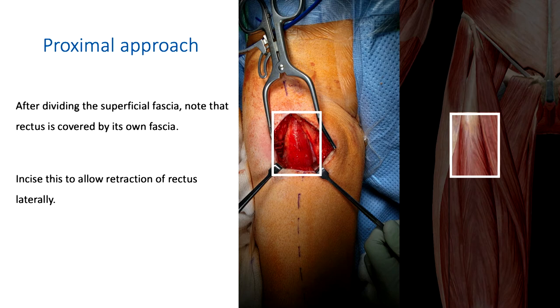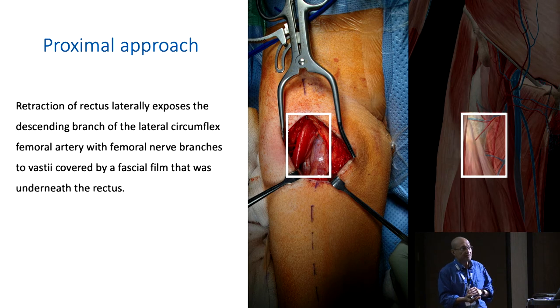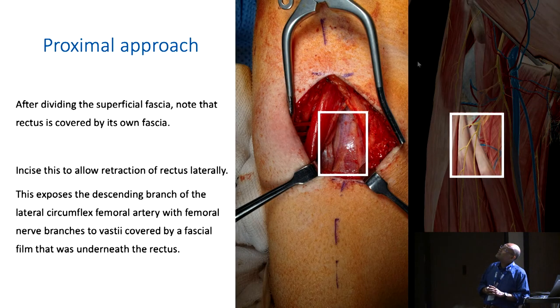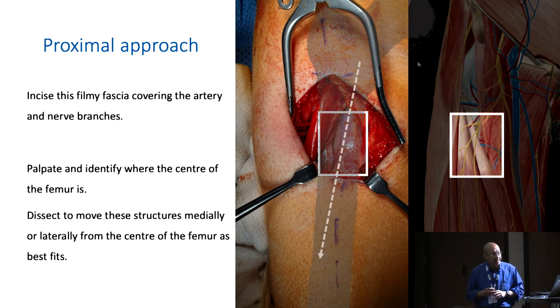Find the medial edge of rectus femoris and retract rectus femoris laterally. When you retract rectus femoris laterally, you will see the undersurface of the fascia — because you've opened the fascia from the superior surface and are now on the undersurface. Through that fascia you will see some nerves and a vessel: the descending branch of the lateral femoral circumflex and some femoral nerve branches to the vastae. Open that fascial layer longitudinally. Palpate and identify where the femur is, as that can guide you which way to mobilize the artery and vessels.